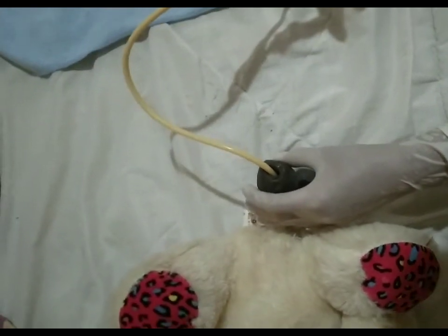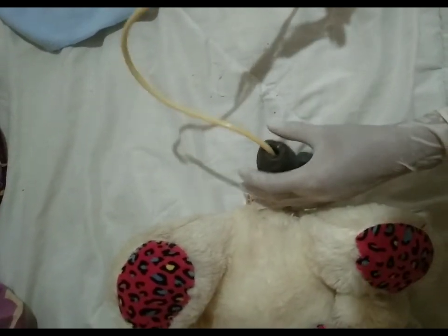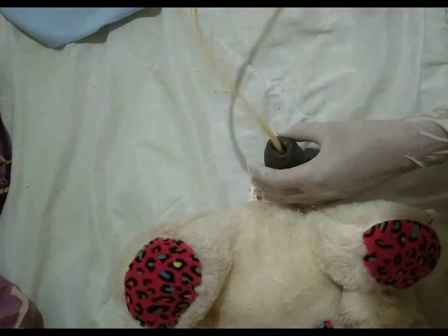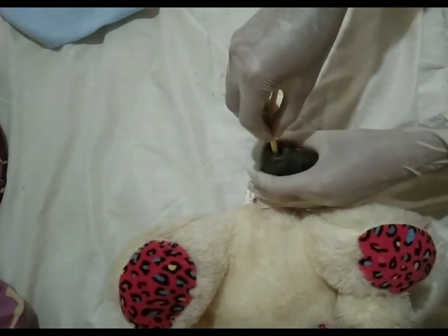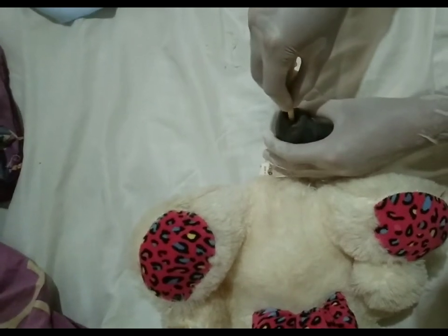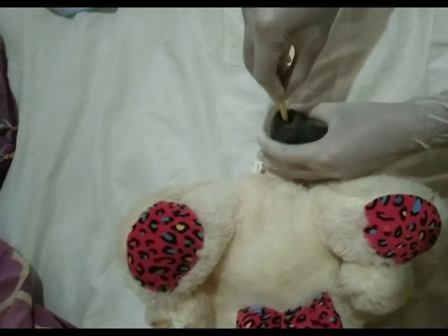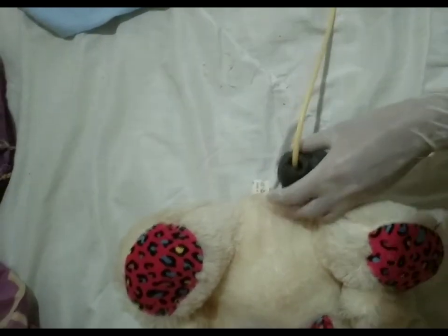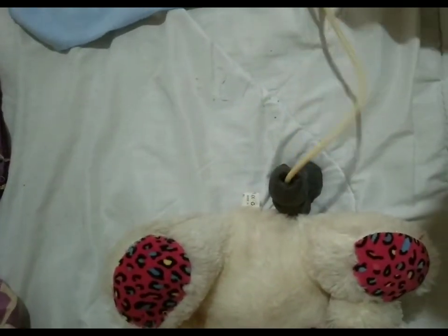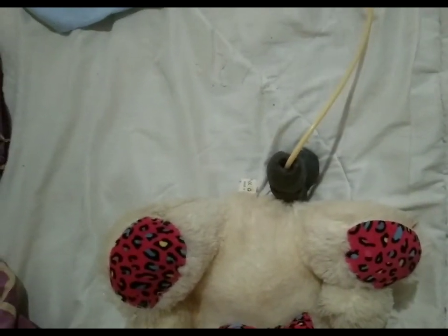Okay, we already injected the water. So now we will pull gently to know that the catheter is in the bladder. Okay, it is already in the bladder. So now we will remove the syringe. Okay, we already removed it.